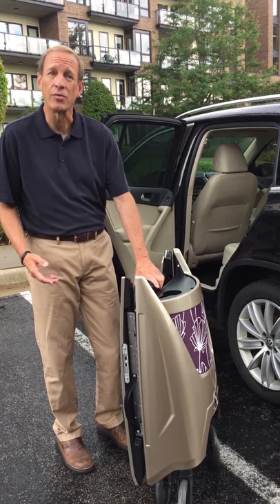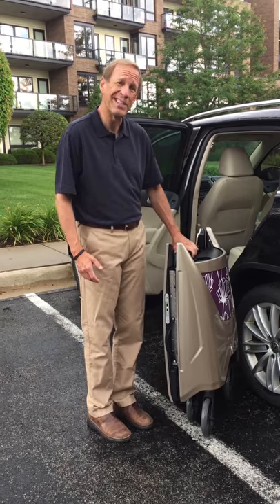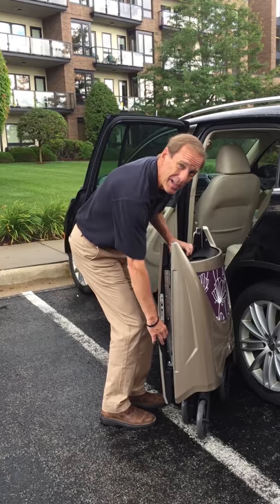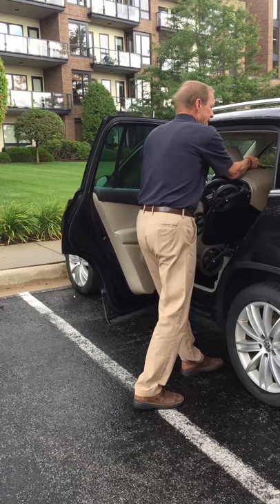First, the Tour stands and rolls on its own, which is nice. When I roll it out to the vehicle, I simply lean it up against the back seat, bend my knees and grab the handle, and gently slide it into the seat.